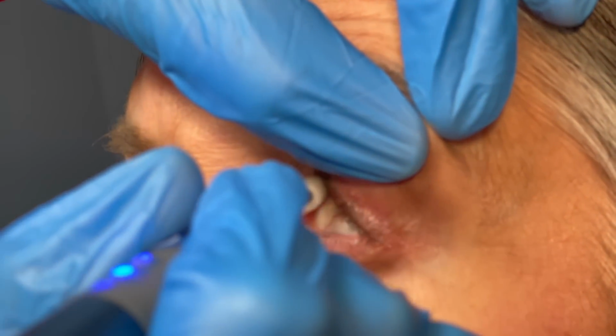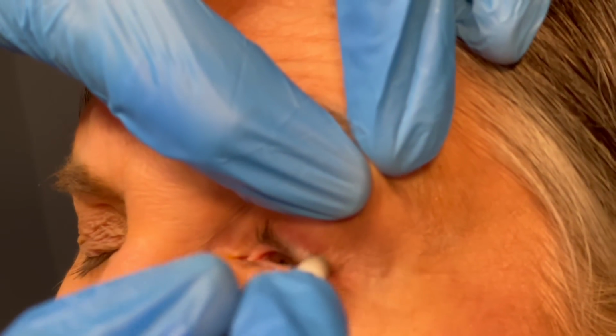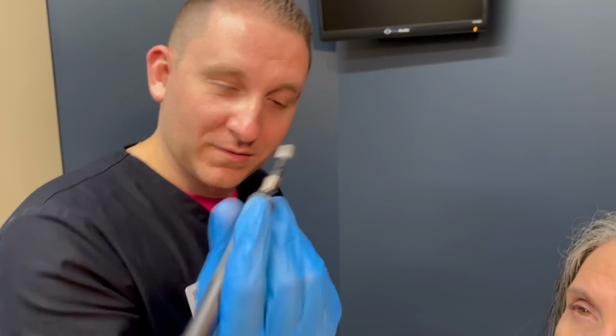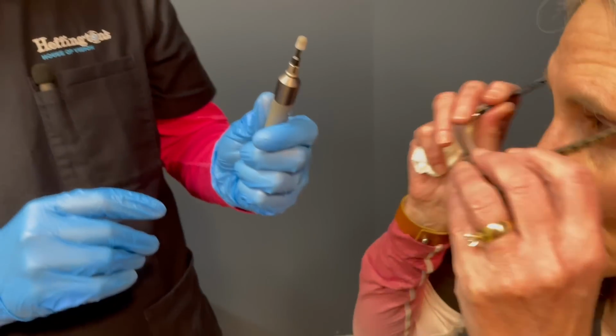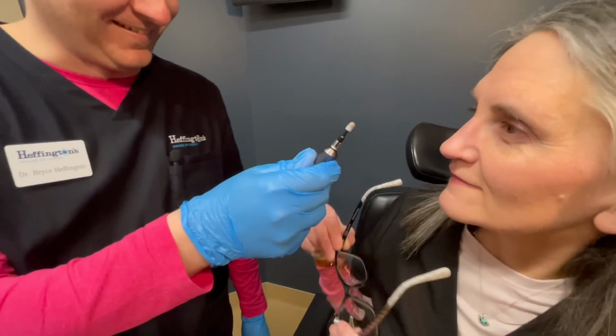Doing great, Mom. Another round of makeup, eyeliner removed. Let me see. Look at all that we just took off of you. But that is how we do the BlephEx.